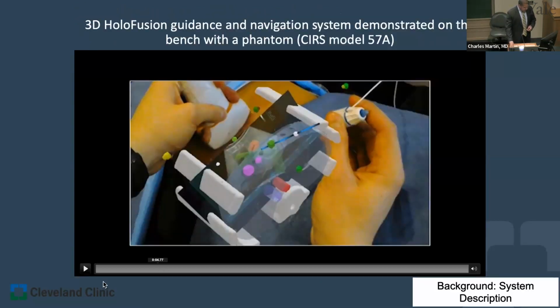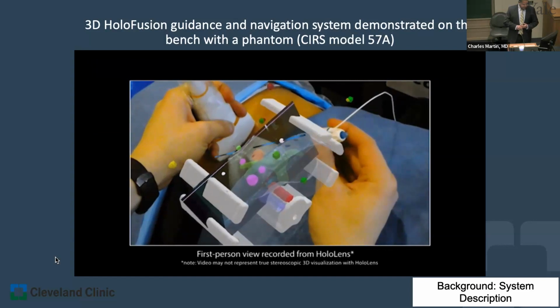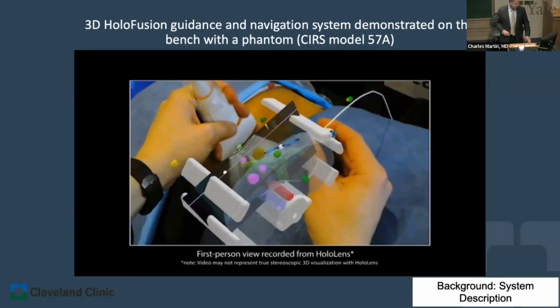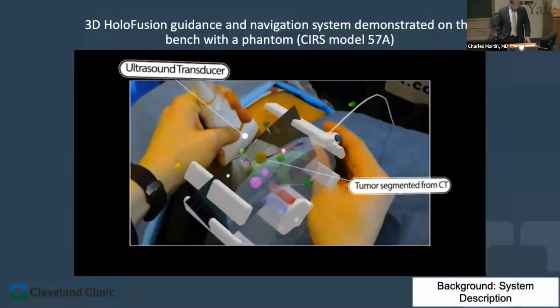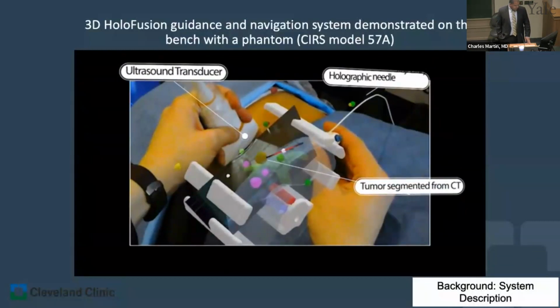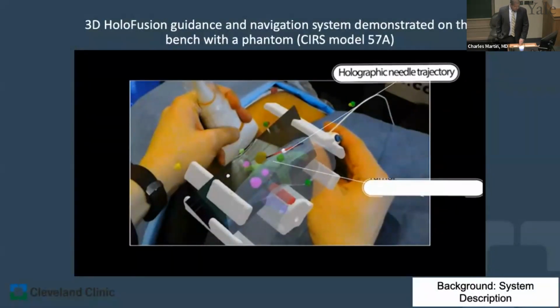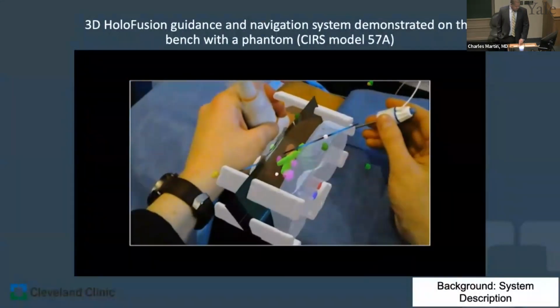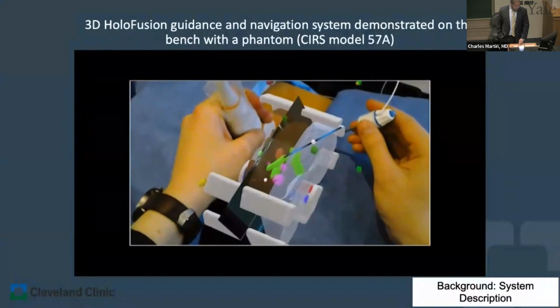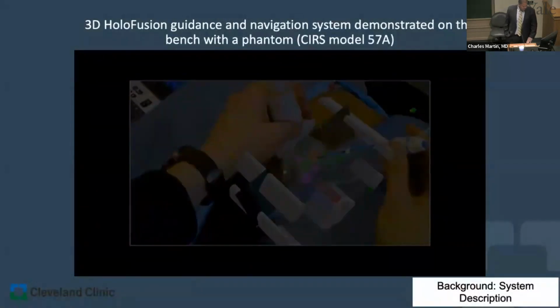And here's another from when we were planning all of this. CT-based holograms and fiducials used for registration into the headset's coordinates are shown for an anthropomorphic phantom. Live ultrasound images extend from the electromagnetically tracked probe, and a holographic needle trajectory extends from the tracked trocar, also in headset coordinates. For accuracy testing, the holographic CT and live ultrasound guidance are used to navigate the virtual trajectory to intersect the target simulated lesions.